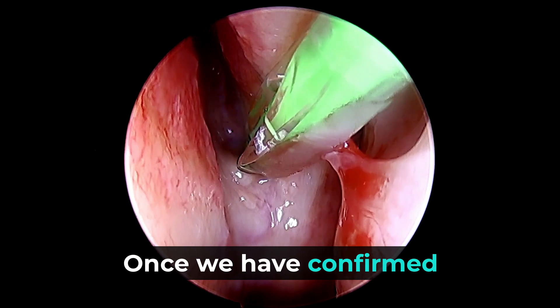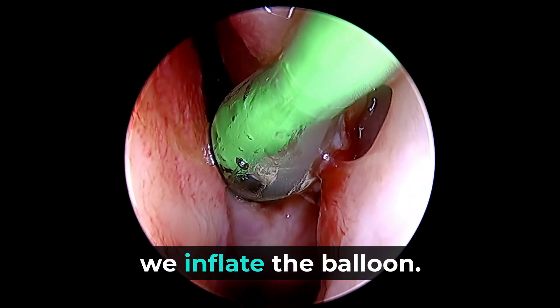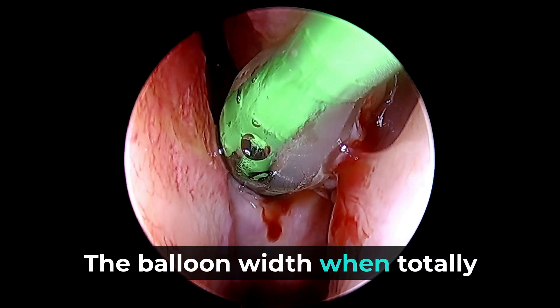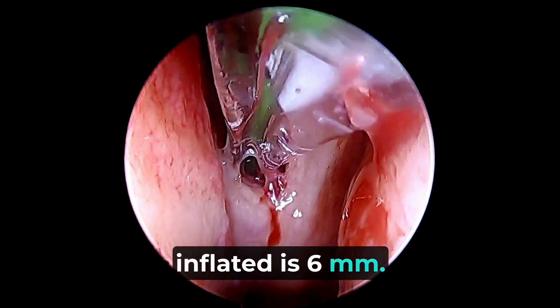Once we have confirmed the balloon location, we inflate the balloon. The balloon width, when totally inflated, is 6 mm.